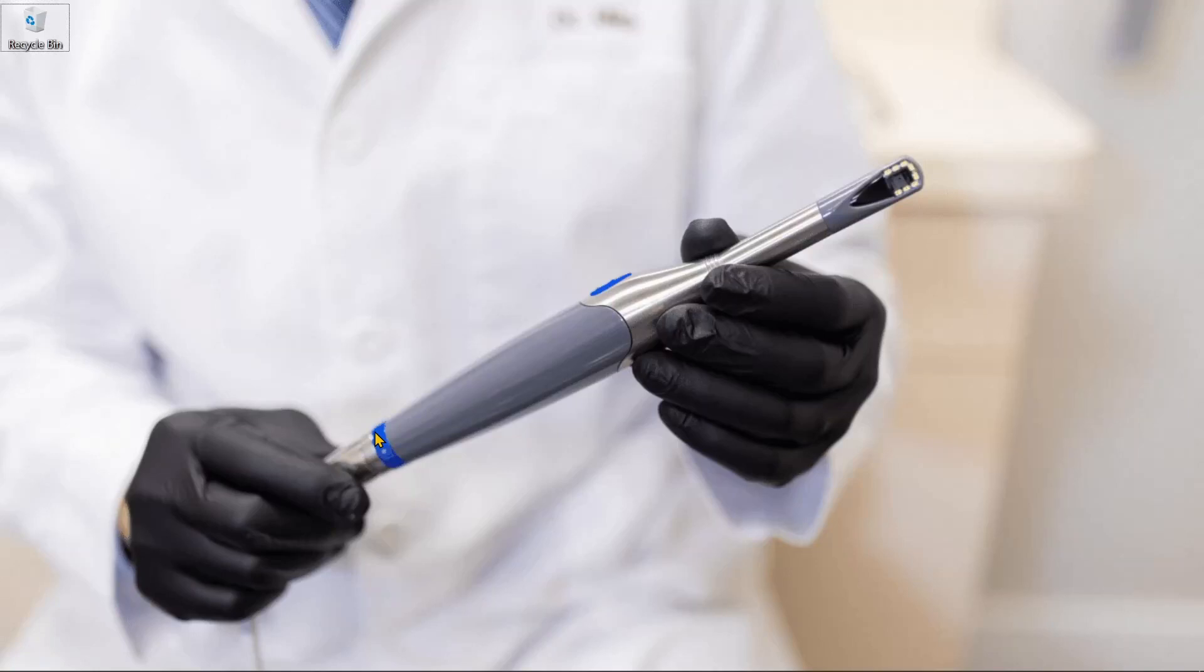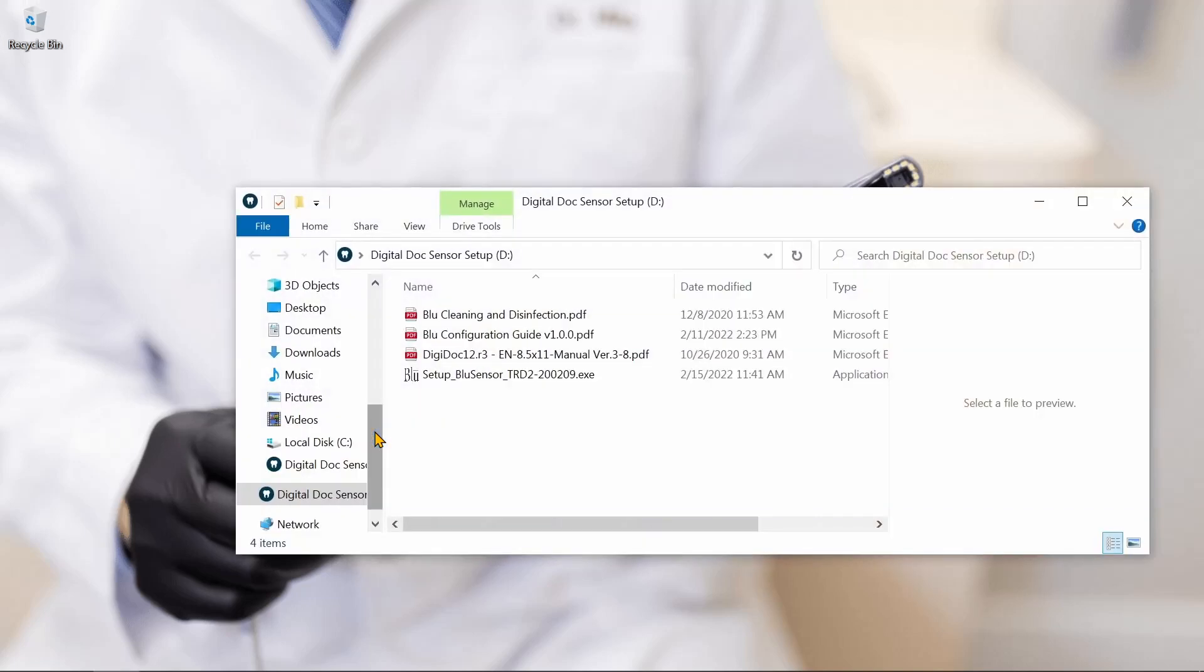Thank you for choosing Digital Doc for your dental imaging needs. My name is James, and I'm here to help you out with the installation and integration of the Blue X-Ray Sensor.